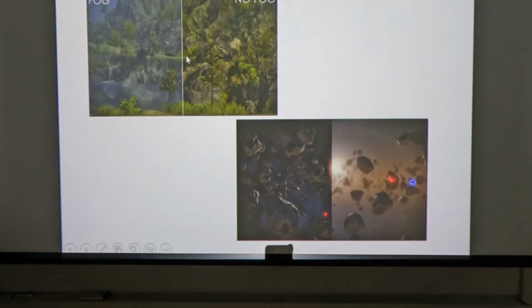So we looked at images for fog versus no fog. The fog, remember, just covers up the sharpness of recorded detail, and that's why we call it visibility of recorded detail, right? So the sharpness is still there. We used a couple of analogies. You're driving down the road on a foggy day. If you drive down the road on a bright sunny day, you can see the trees and everything, but the fog on a foggy day doesn't remove the trees, it just covers them up so you can't see them real well, right? Same thing on the x-ray image.